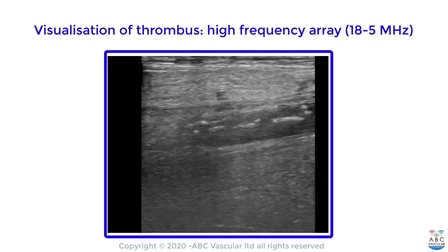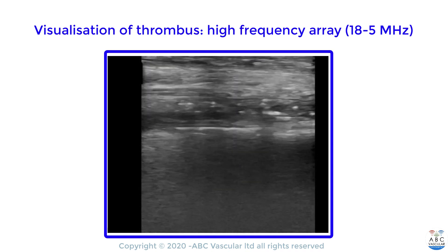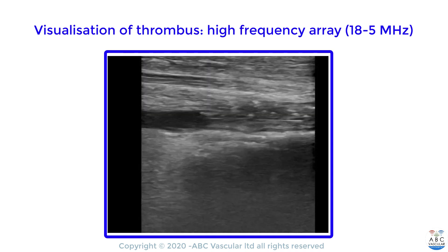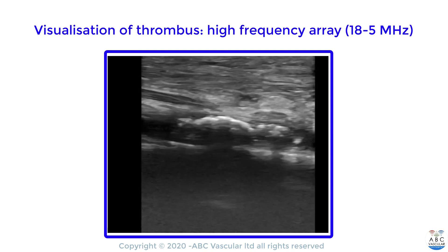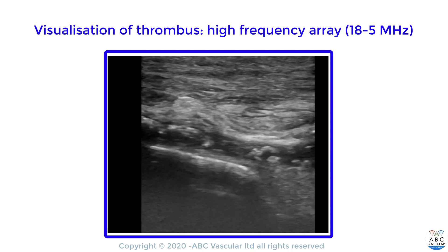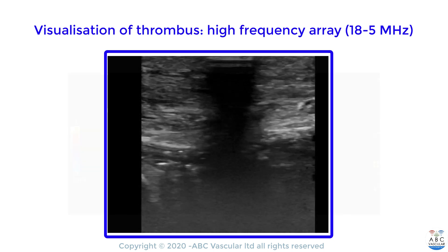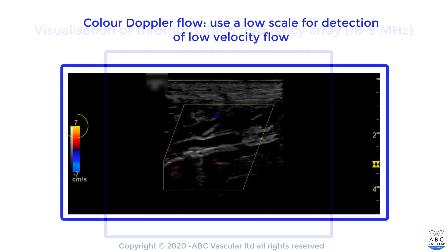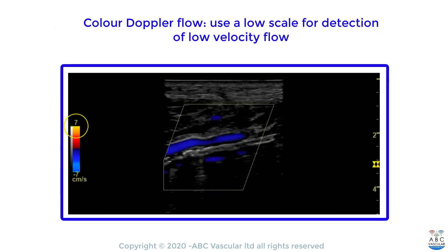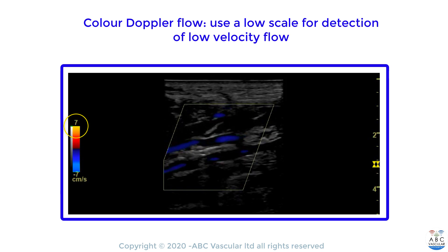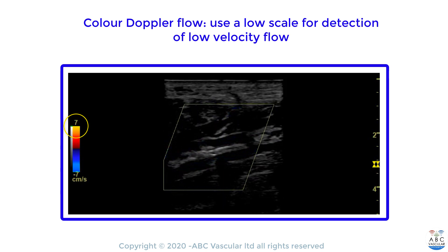Such transducer is very useful in determining the very distal posterior tibial artery, as these lie very superficially under the skin. In order to confirm the presence of an occlusion, we can use color doppler flow. We must use a very low color flow scale, as represented in this video, in order to detect any low velocities.